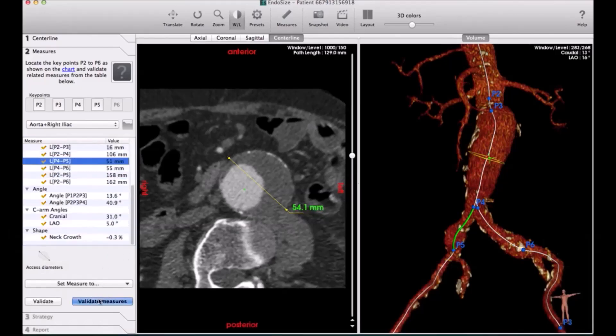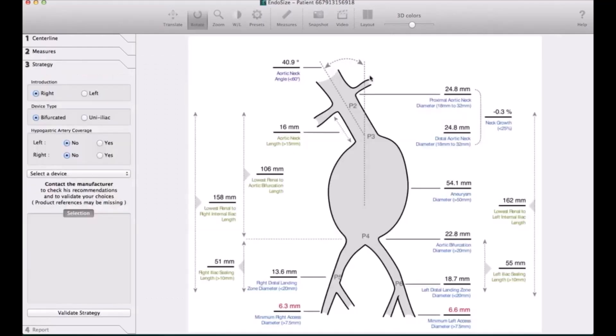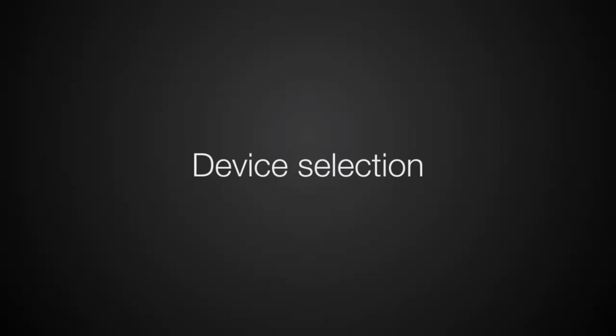You can tell the machine this is the amount of thrombus and this is the amount of the lumen. Then you confirm your measurements to go to the next step, which is the sizing.